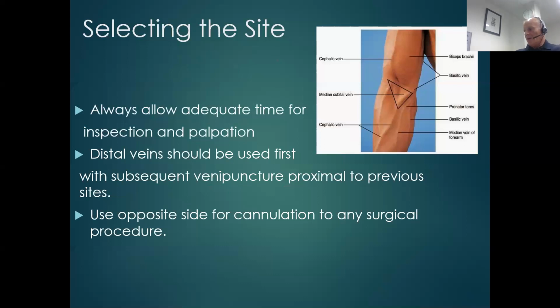Use the opposite side to any surgical procedure for cannulation, very much hospital related, this one. And try to use the non-dominant arm if possible. Just ask them, are they left-handed or right-handed?